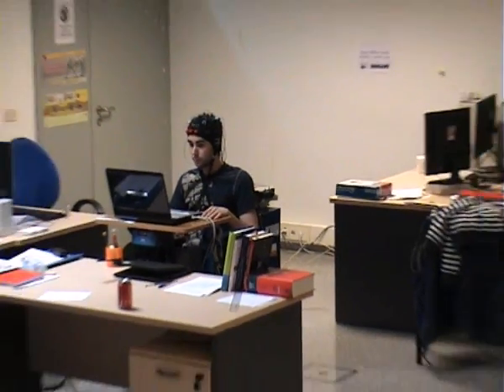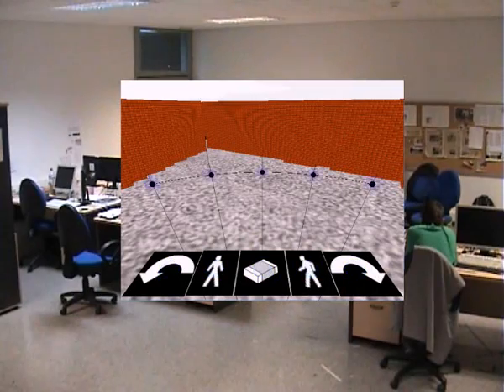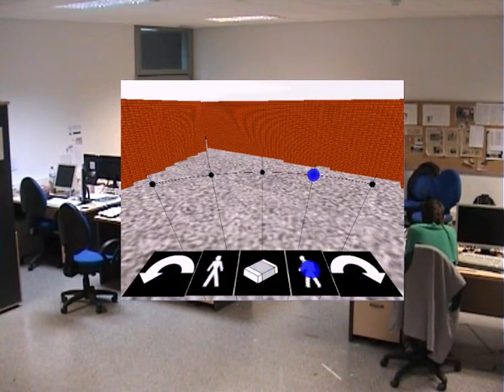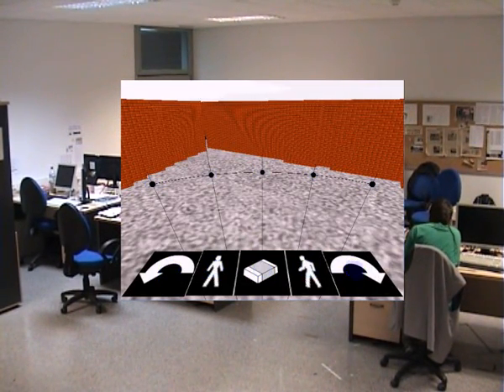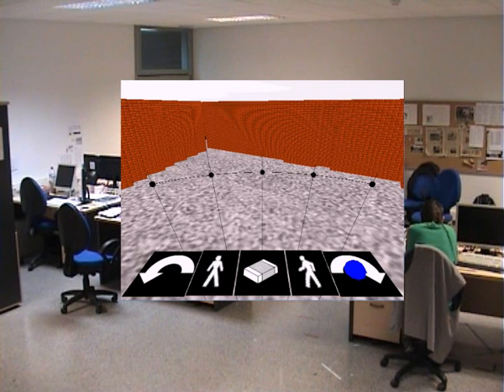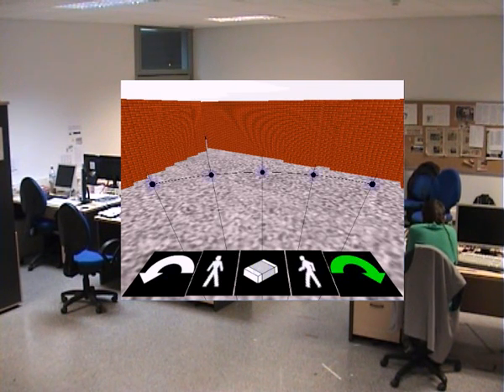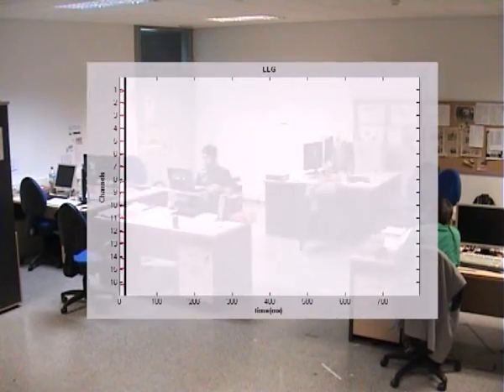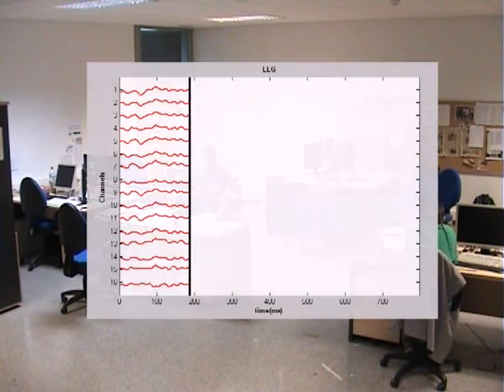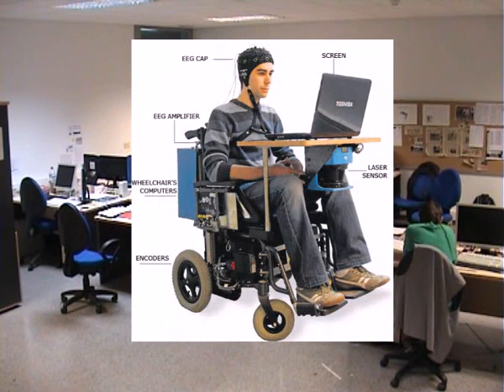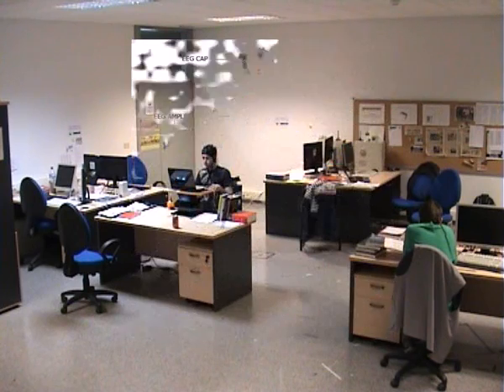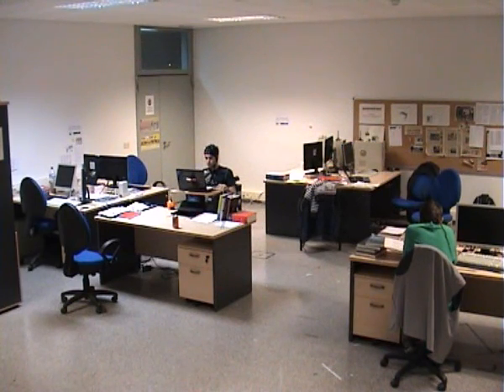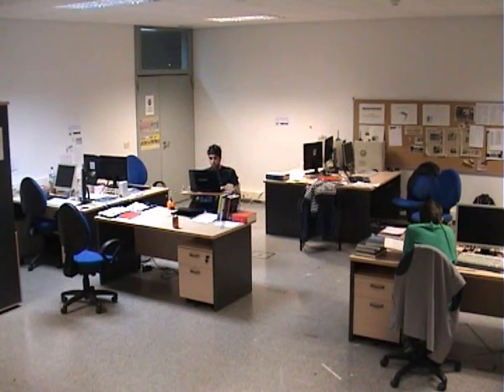When in operation, the user faces a screen displaying a real-time virtual reconstruction of the scenario and concentrates on the location to reach. A visual stimulation process elicits the neurological phenomenon, and the EEG signal processing detects the target location. This location is transferred to the autonomous navigation system that drives the wheelchair to the desired location while avoiding collisions with obstacles detected by the laser scanner.